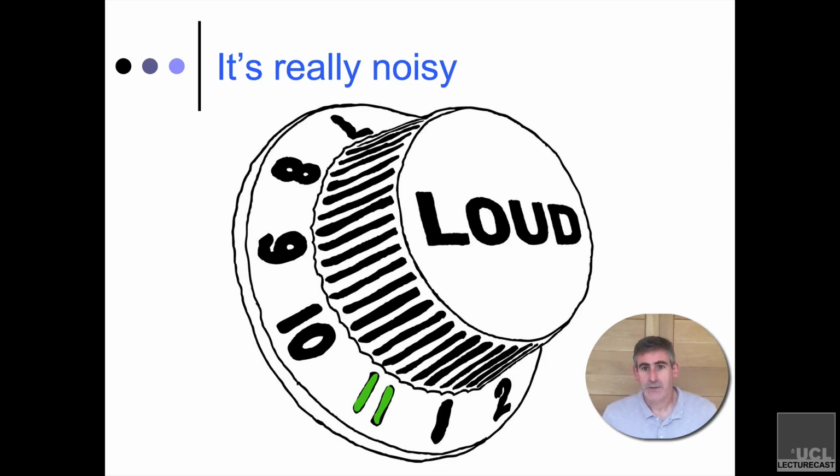This one seems so obvious that it's probably not worth mentioning, but I actually think that sometimes we can sort of miss the elephant in the room. MRI scanners are loud, and they're really loud because the magnets that are used to create the big magnetic field are always on. In addition, the gradient magnets, the magnets that allow us to encode space by manipulating the field in the three different directions, are magnets in a magnetic field. And magnets within a magnetic field cause sounds. That's what Lorentz forces are. They cause it to physically vibrate, which causes movement in the air, which causes noise.